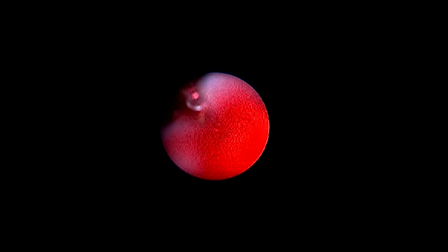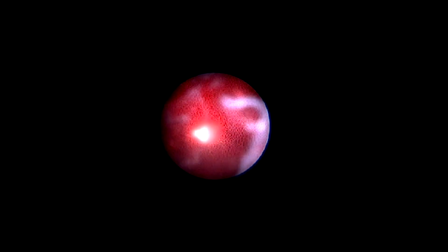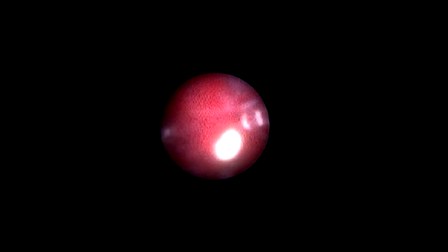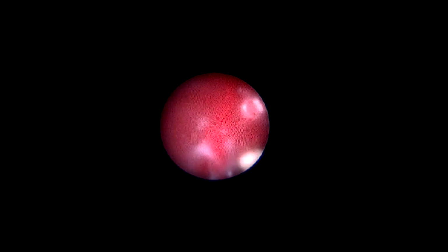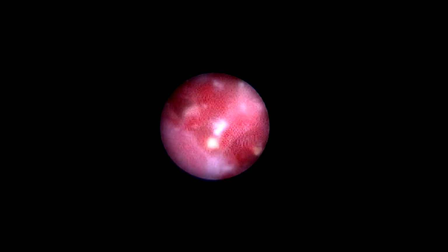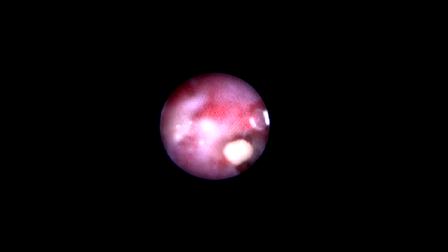And here we've got some video of what we actually find when we're inside this diverticulum. You can see that instead of it being a single stone, what we've actually got is multiple small stones. These are tiny stones which have accumulated because they're essentially in a big dilated cavity. They're moving around. They can't get out of that cavity because of the very narrow neck. And what we're able to do is just free them up from the blood clot that our dilatation has obviously caused. And then using the effect of the ultra mini PCNL and the Venturi effect, those tiny little stones will then follow us out and be collected and sent off for analysis.